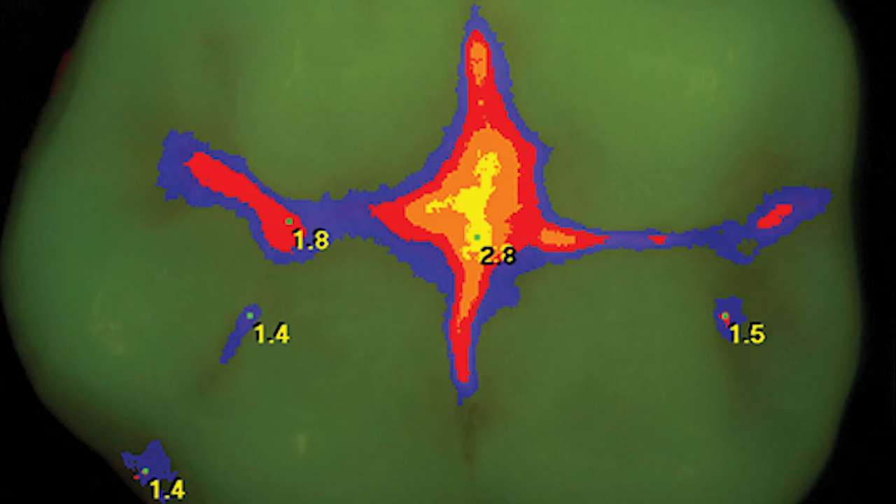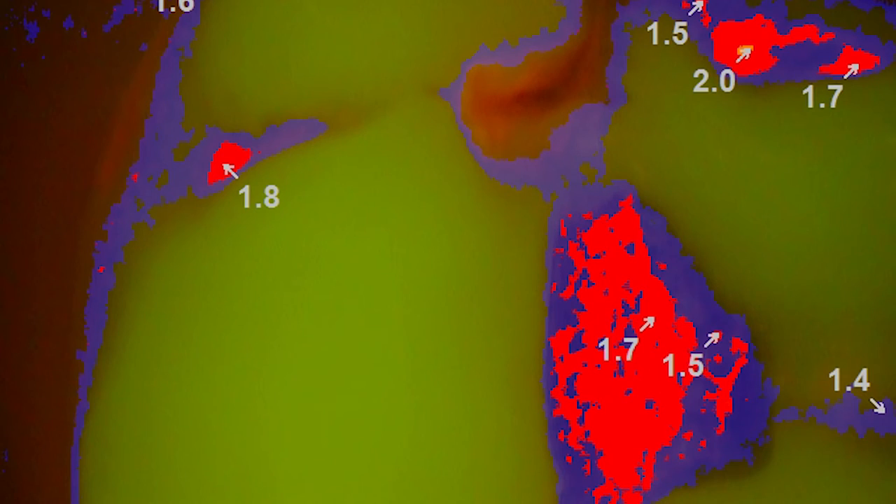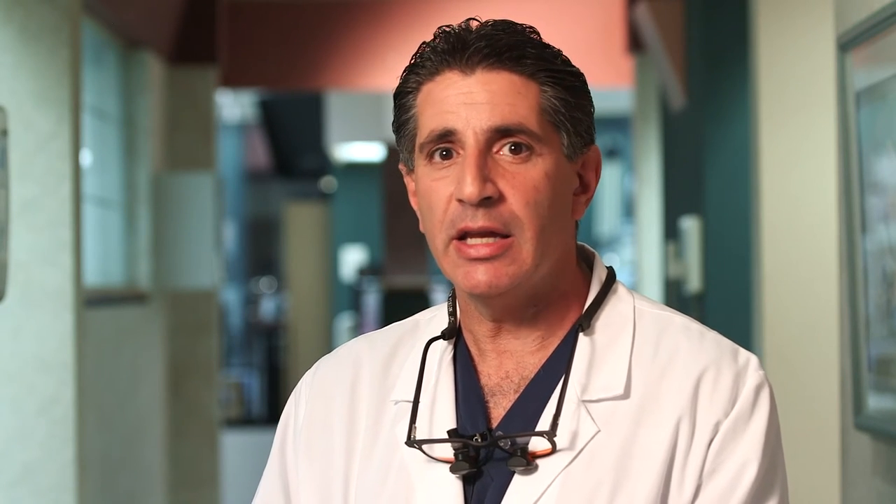Spectra will also provide us with a numerical value for each image. Anything ranging from 1 to 1.5 indicates a very small caries area, and we will typically treat with remineralization or sealant-type products. Areas of 1.5 to 1.9 we will treat with minimally invasive dentistry, such as a prep and a sealant. Any caries indicated with 2 or more will need traditional dentistry.